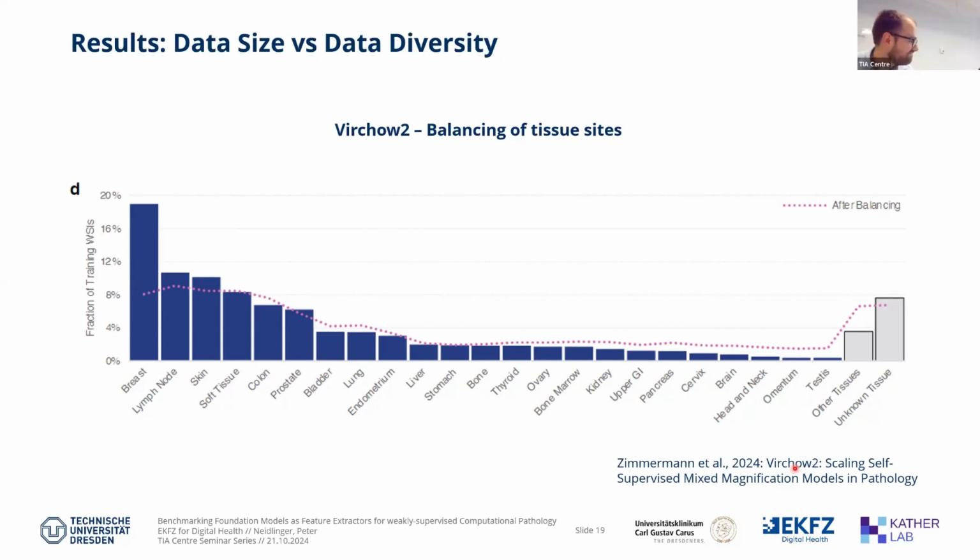Cool. And the other quick question. You said that in this STAMP pipeline you're extracting patches at around 1 MPP. Some of the foundation models have been trained mostly on slightly different resolutions. So is it possible that some of the models are not performing at their best because the patches aren't extracted at their ideal resolution? That's definitely a good point, and might be true to some extent.